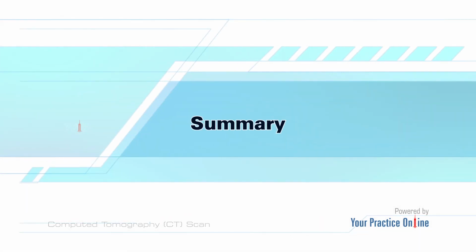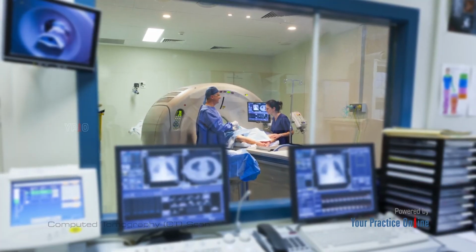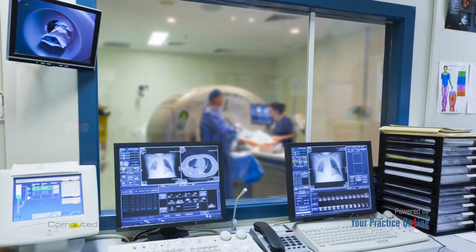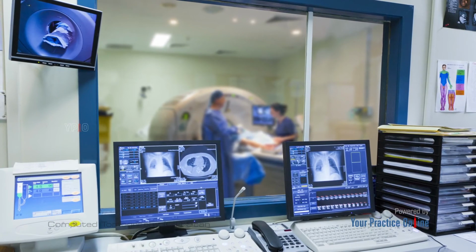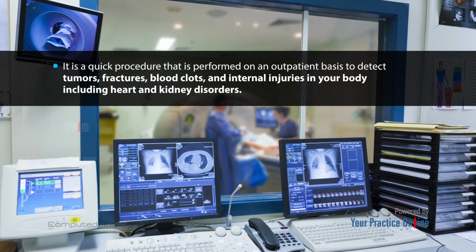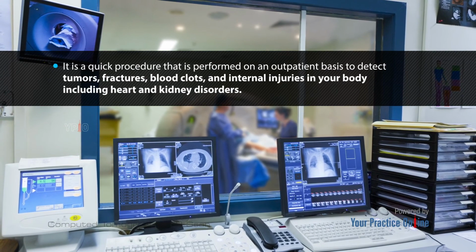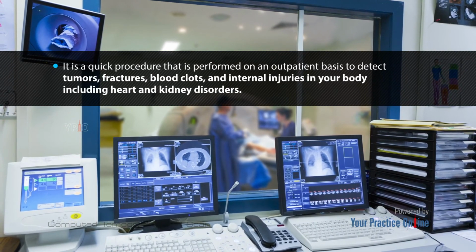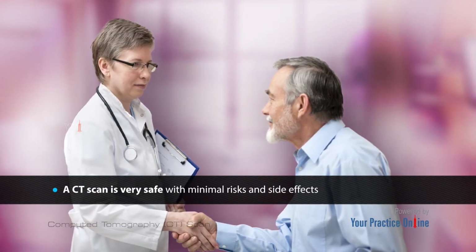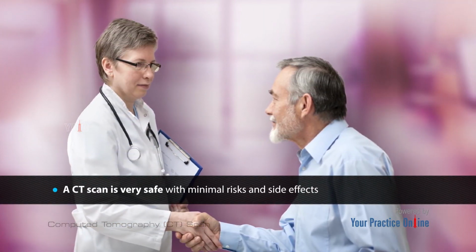Summary. A CT scan is a diagnostic imaging procedure that generates detailed images of your blood vessels, soft tissues, and bones. It is a quick procedure that is performed on an outpatient basis to detect tumors, fractures, blood clots, and internal injuries in your body, including heart and kidney disorders. A CT scan is very safe with minimal risks and side effects.